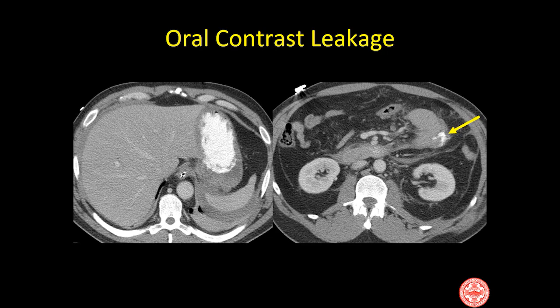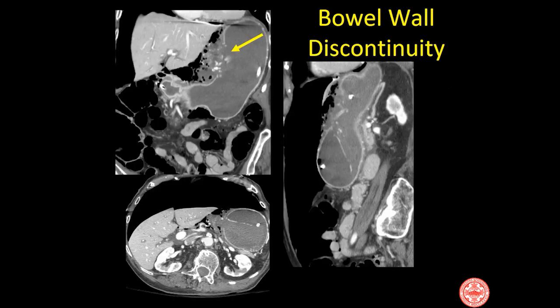Here's one example from when we used to give oral contrast — we can see extraluminal contrast arising from this injured loop of small bowel. But notice it is not the only sign: there is blood in the mesentery, stranding in the mesentery, and bowel wall thickening. So even without oral contrast, we should have been able to make this diagnosis.